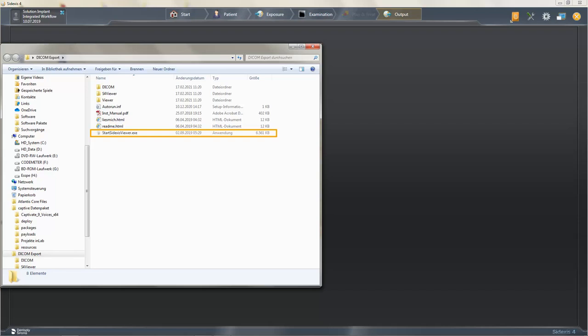A practice that would like to use the Sidexis 4 viewer can install it by double-clicking on the startsidexisviewer.exe file. The DICOM files are then imported automatically.